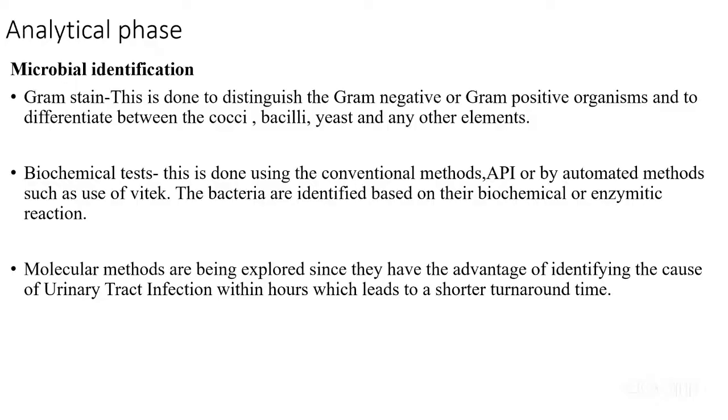Then we have the API system. It is a set of wells in one strip. Once you get your organism, you emulsify it and you pipette and put the organisms in the wells. Once you are done placing the organisms in the wells, you incubate according to the instructions given.